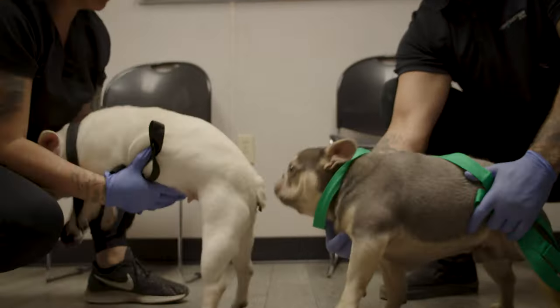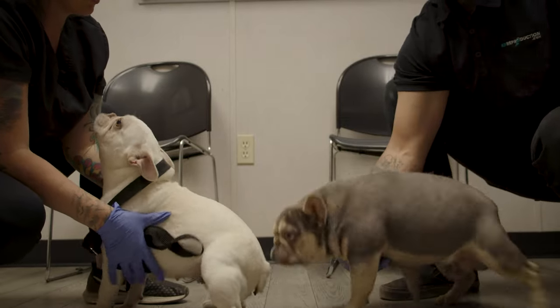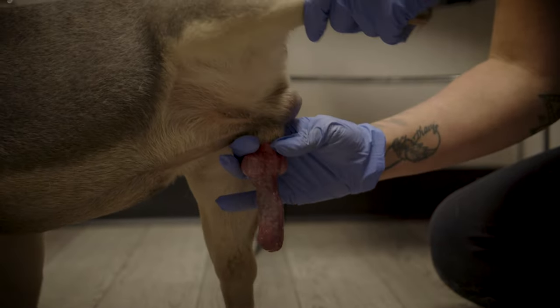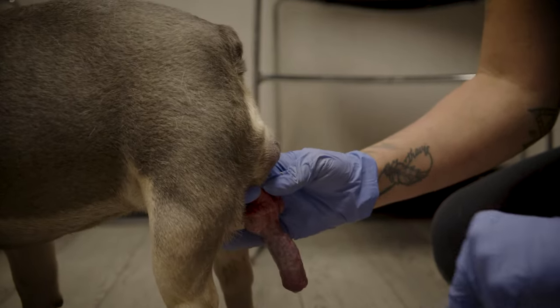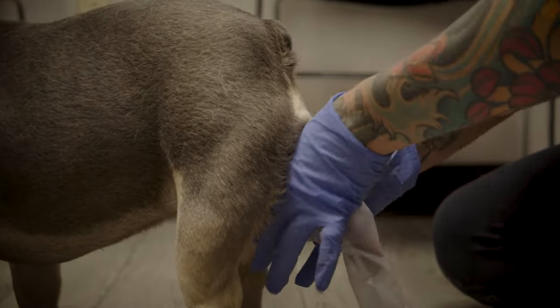First, you will need to have the female standing in front of the male. This will help the male gain interest and become aroused. Then you will stimulate the male until the knot starts forming. Once aroused, you will pull the sheath behind the knot. You can then gently pull back on the shaft and insert into the collection bag. The dog usually will be collecting for about three to five minutes.